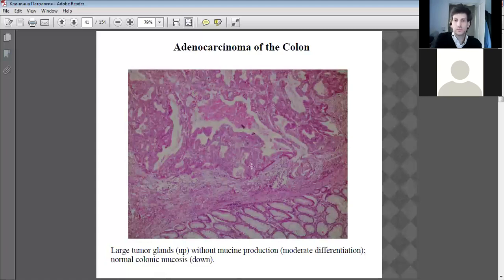What's dividing the normal areas and tumors? Okay. This area here is fibrous tissue, and it's an attempt of the body to encapsulate the tumor. So it's trying to prevent the migration of the tumor further. And this is why a lot of the tumors are quite hard to touch in pathology post-mortem, because the capsule is really hard. So this is an attempt of the body to isolate the tumor. It's a dangerous one, adeno. Why is it dangerous? Because it can easily spread from the colon into the bloodstream.